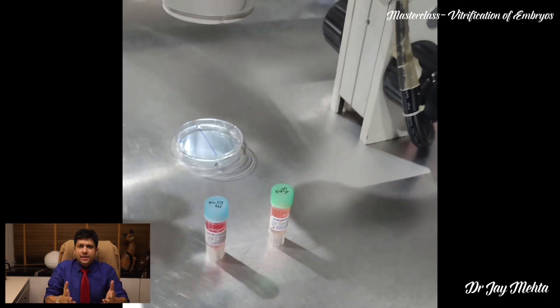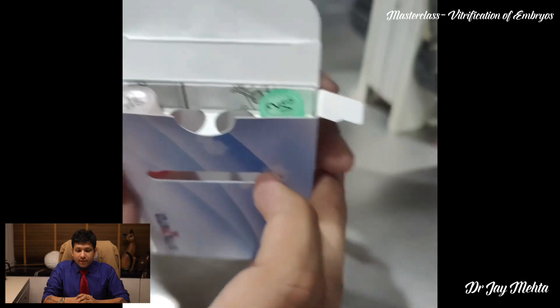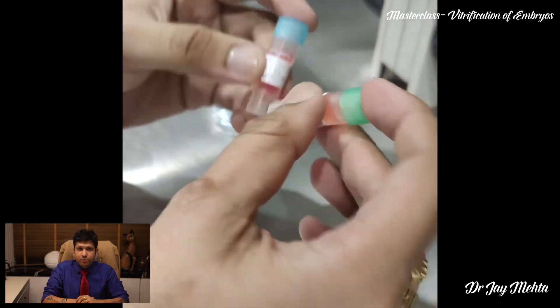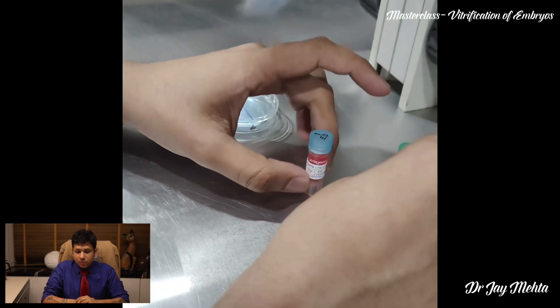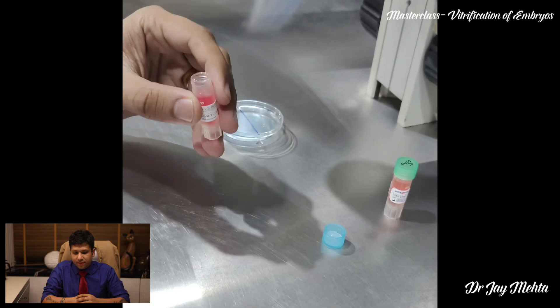Vitrification is basically a technique of rapid freezing. As you see, we have three solutions: the basal solution which is BS, which we normally don't use, and here are the two solutions — one is ES, the equilibration solution, and the second is the vitrification solution.